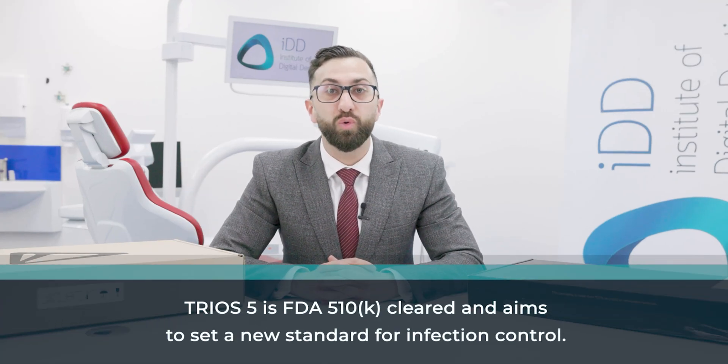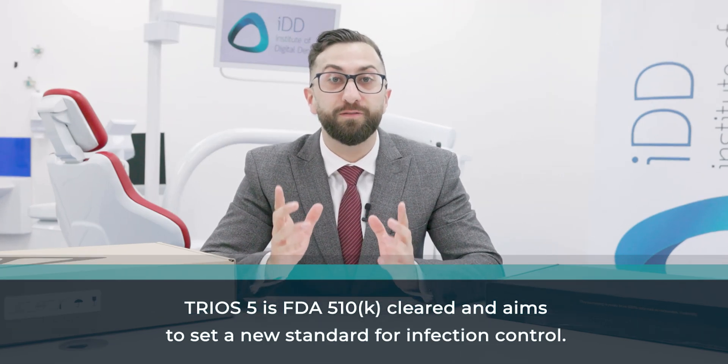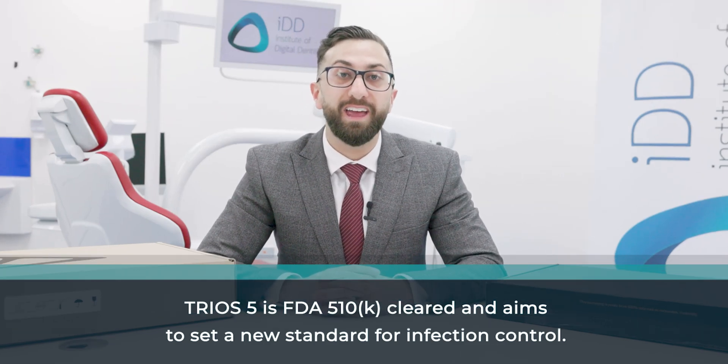The Trios 5 is a total upgrade to the Trios 4, and it's been completely redesigned inside and out. 3Shape says this product will take scanning to the next level, unlike the Trios 4, which should have really been called the Trios 3.5, as it was only an incremental improvement over the Trios 3. The Trios 5 has an entirely new optical engine. The company says it has been in development for four years, and they have made over 50 improvements compared to older generation scanners.